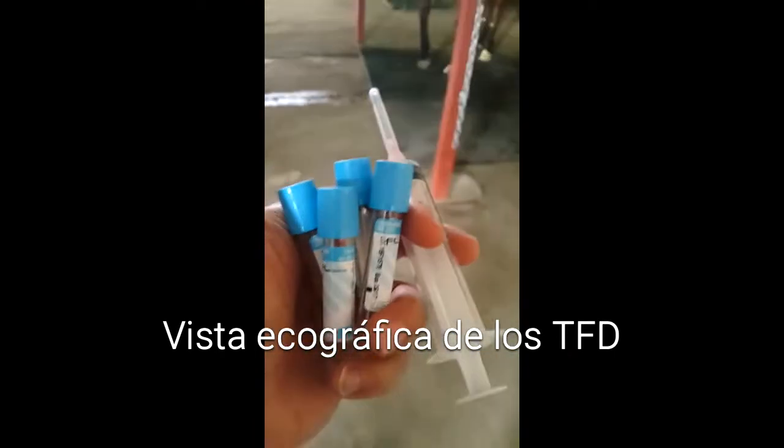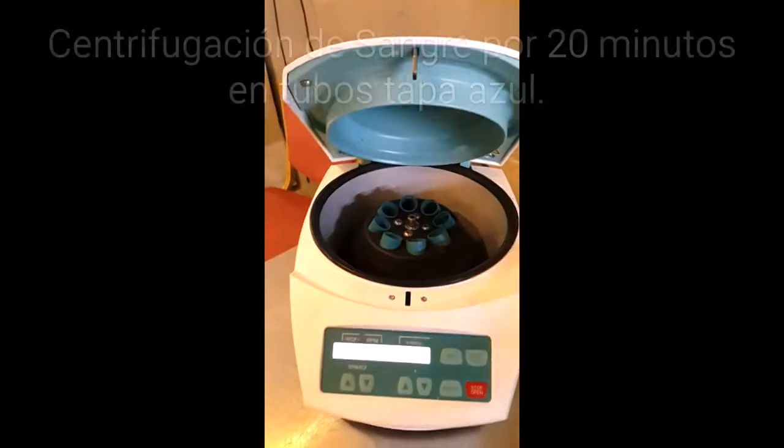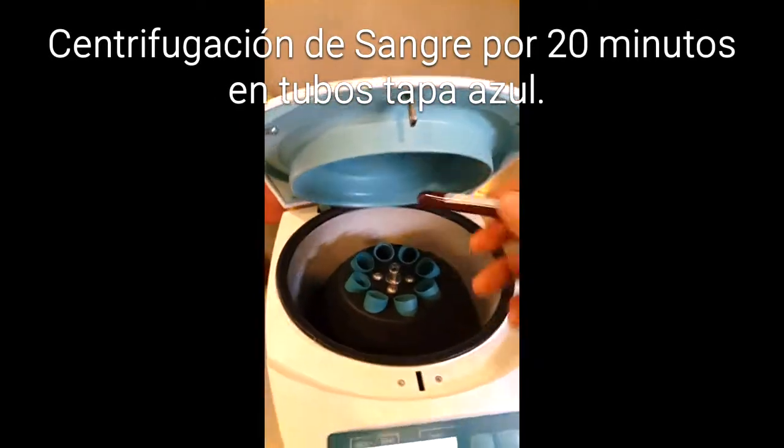Here I have the tube with citrate of sodium. I am going to take the blood samples to centrifuge the plasma rich with the platelets. This is the tube of the blood, which I move slowly.